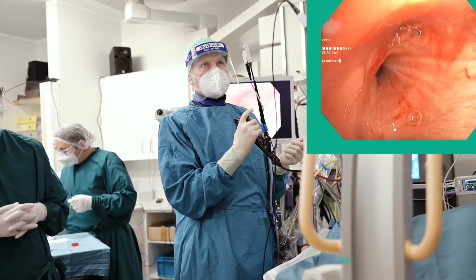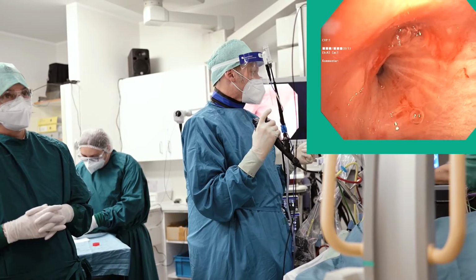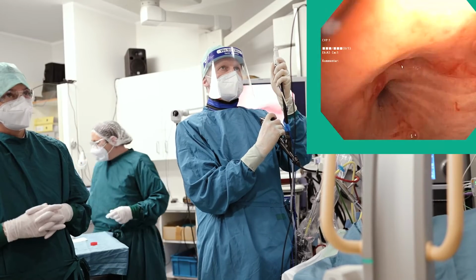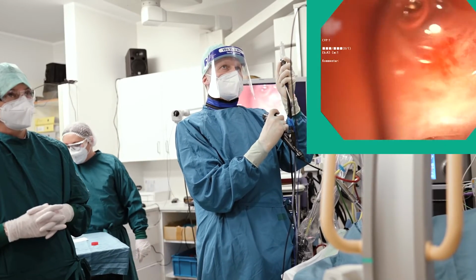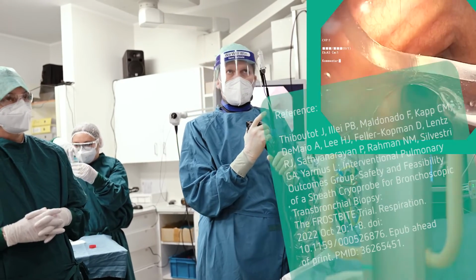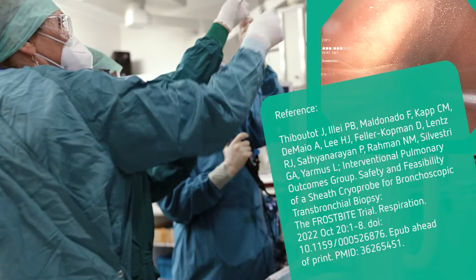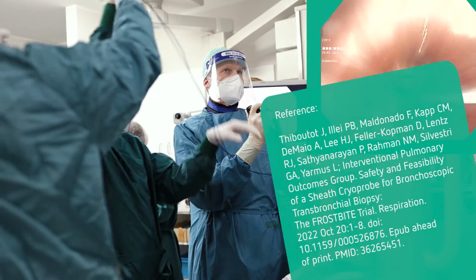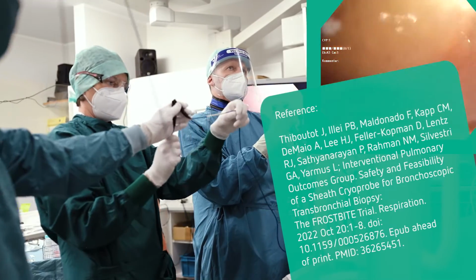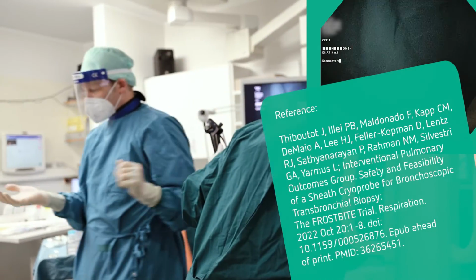In most cases, the extended working channel wedges the airway leading to the lesion and helps prevent blood from flowing to further pulmonary areas. Cold saline or vasoconstriction agents are readily available to support bleeding management in case they are needed. The frostbite study demonstrates that transbronchial cryobiopsy using a 1.1 mm cryoprobe through a sheath can be performed safely under standard flexible bronchoscopic conditions. It has a similar complication profile to forceps biopsy in the past.